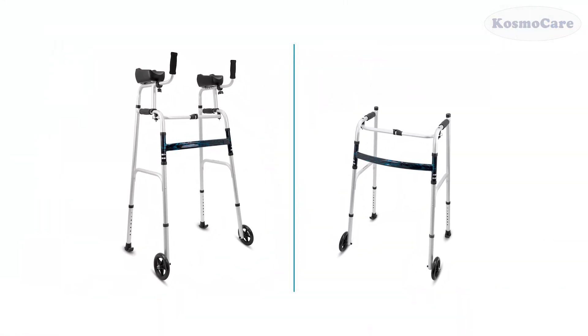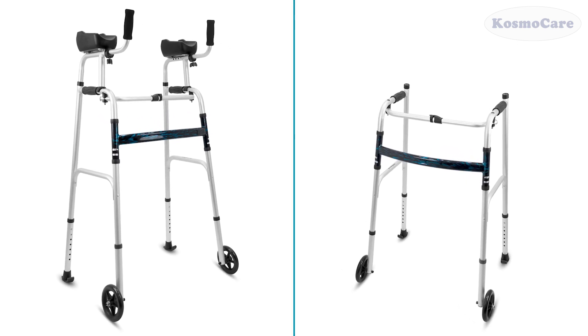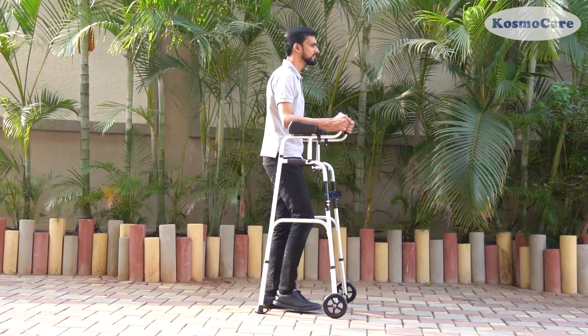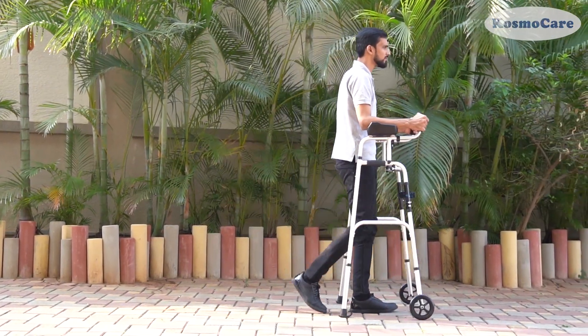The Upright Walker boasts a detachable forearm support. With it attached, users can walk upright without the need to lean forward, promoting proper posture and stability.